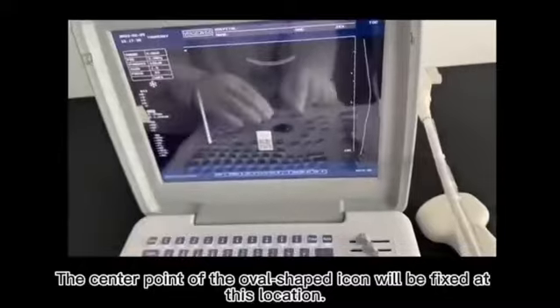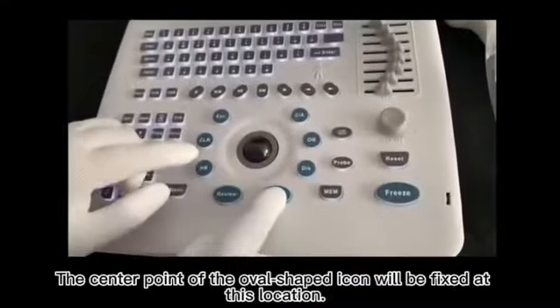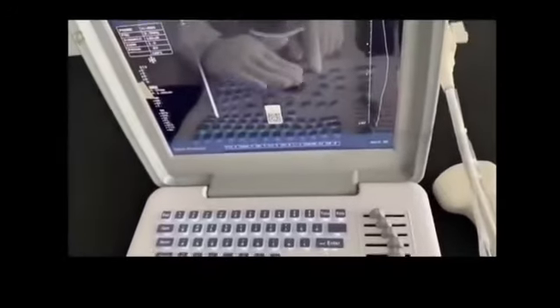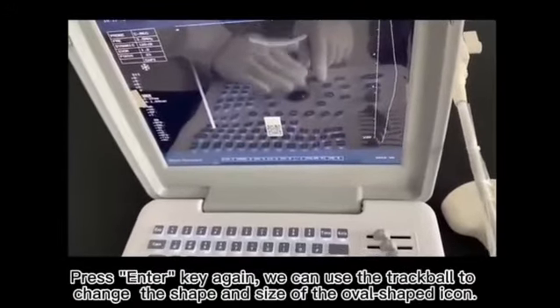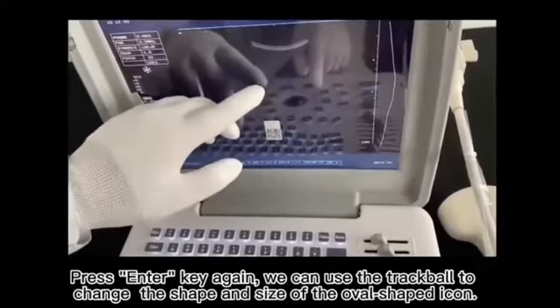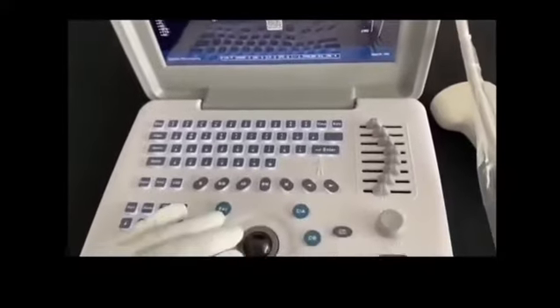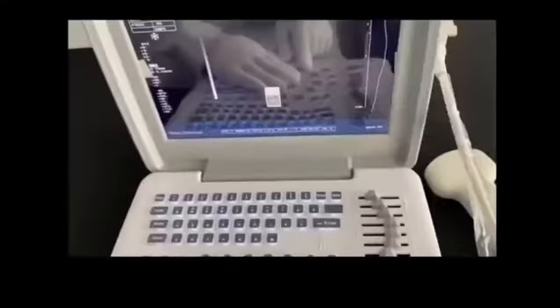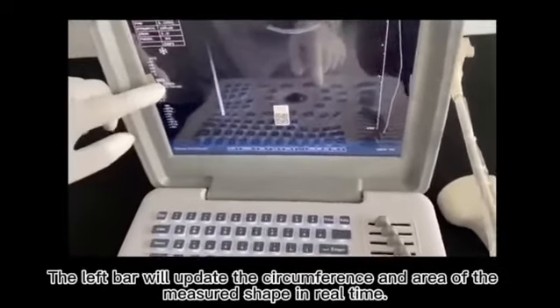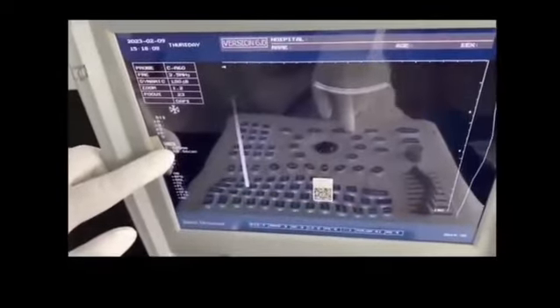The center point of the oval-shaped icon will be fixed at this location. Press the Enter key again. We can use the trackball to change the shape and size of the oval-shaped icon. The left bar will update the circumference and area of the measured shape in real time.